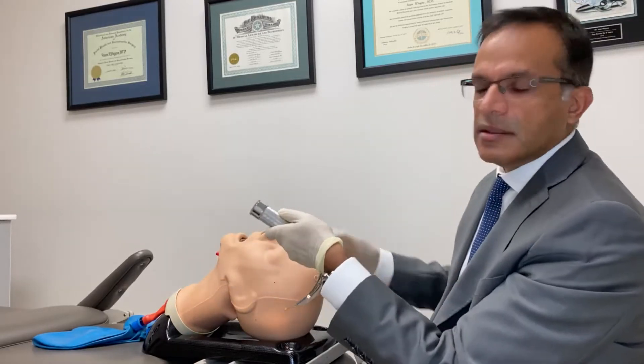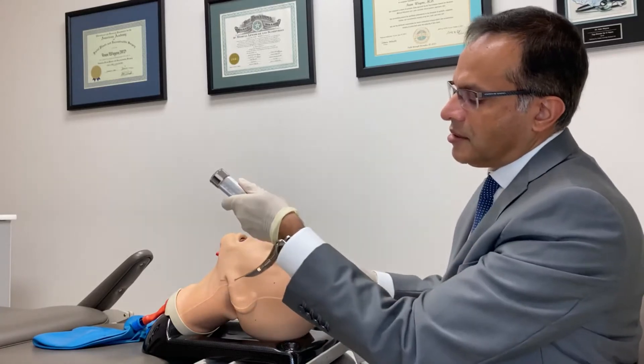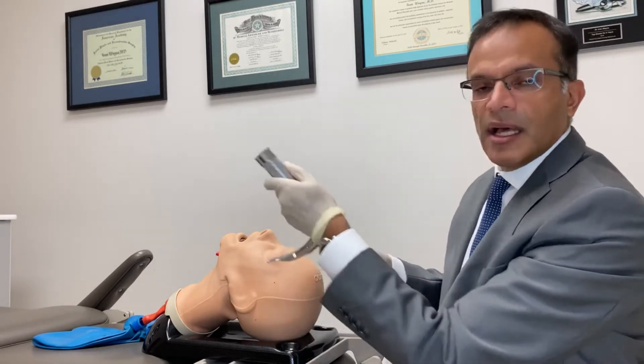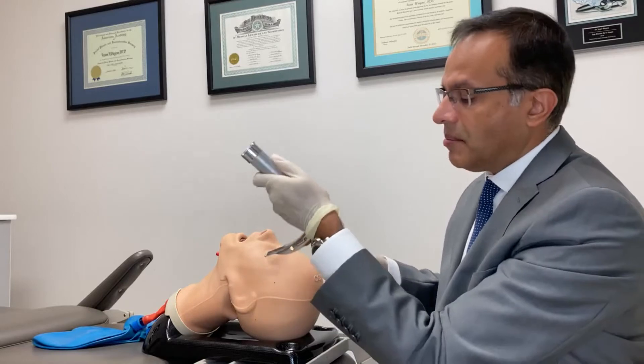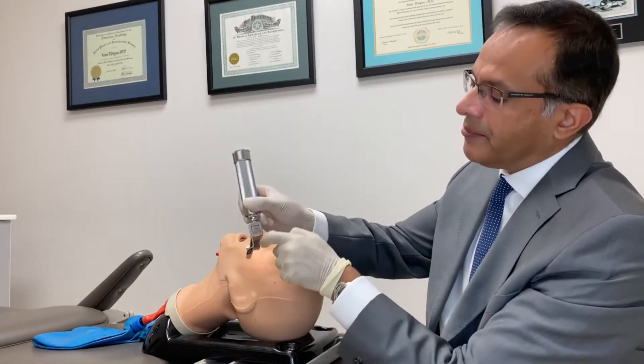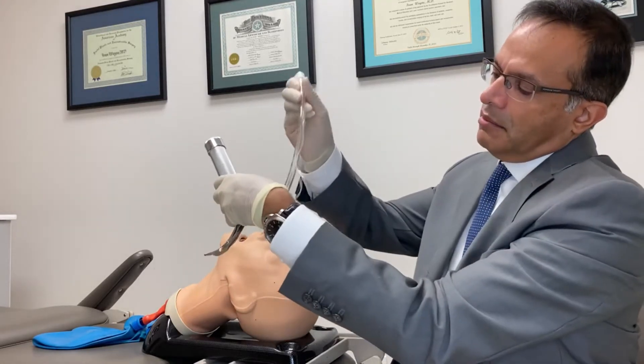Why? You want to push that tongue upward and away from you so you can get the tip of the blade into the vallecula and hopefully visualize the larynx, so you can pass an endotracheal tube through the right side. It's got a large channel so you can pass a very big tube.